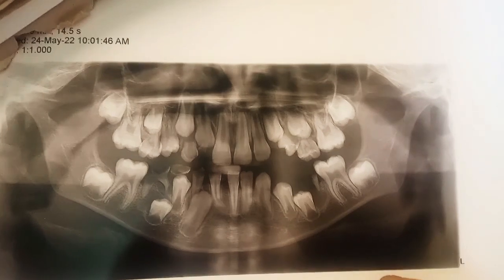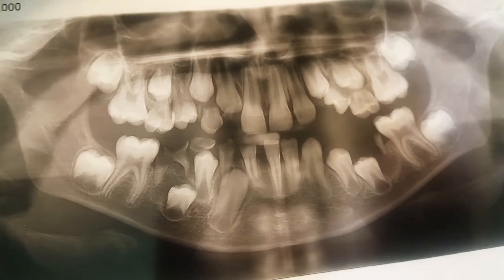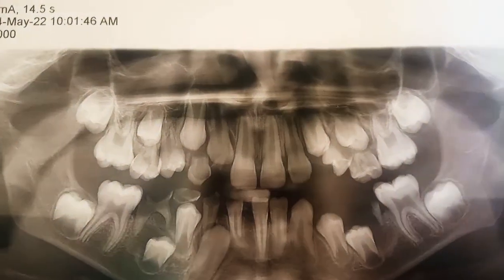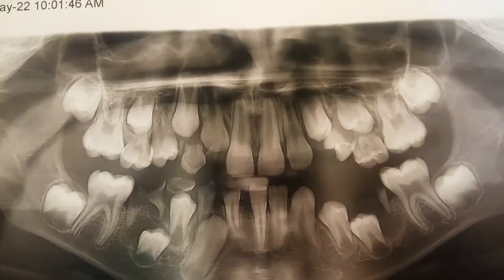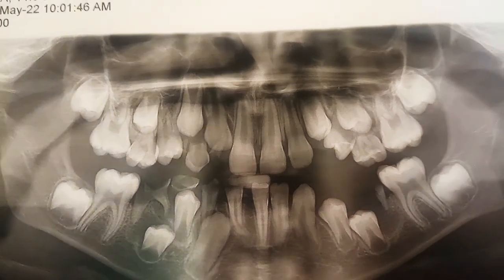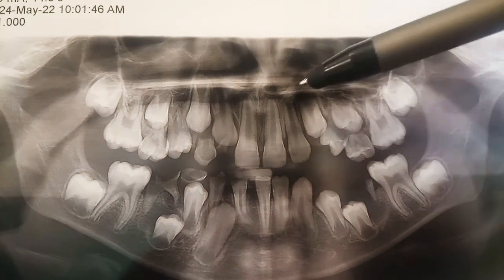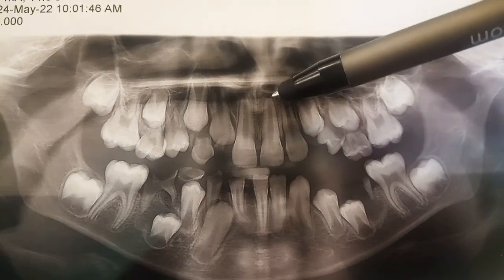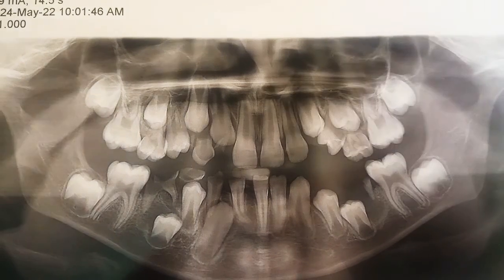During this session you might have recognized a deficiency in this OPG. You may have noticed that there is a missing lower mandibular first incisor. On taking the history, the patient stated that he had his lower first central incisor extracted. You can also notice the open apices of the lateral incisors — both have open apices.